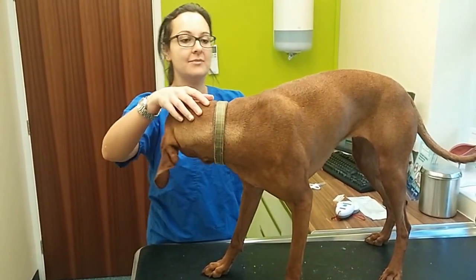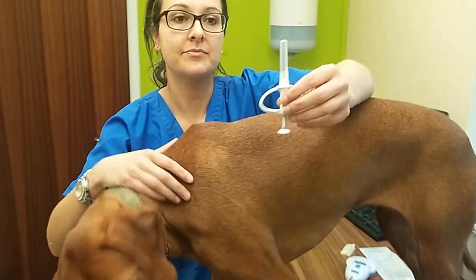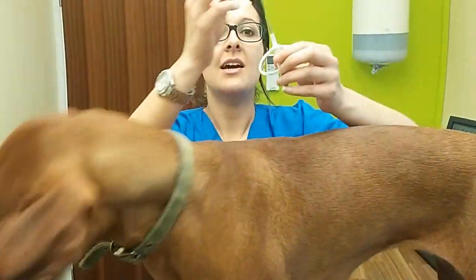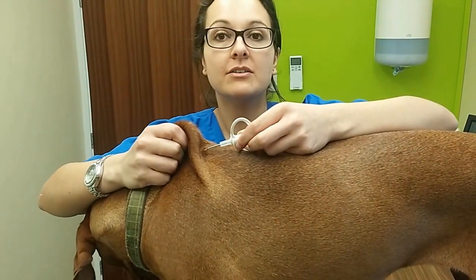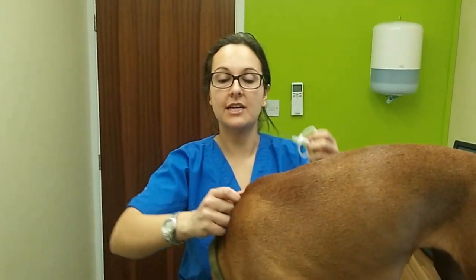What we do to microchip is the needle looks like this. We just place this just underneath the scruff, usually around about the shoulder blade region there, and then you inject the chip.